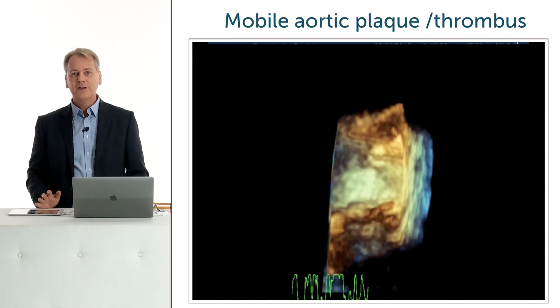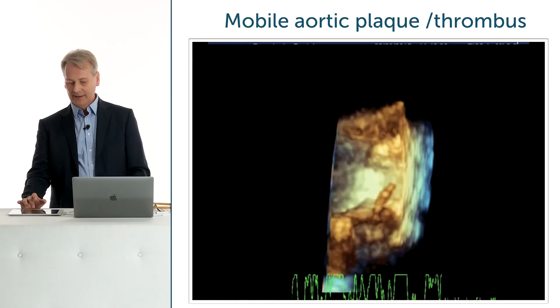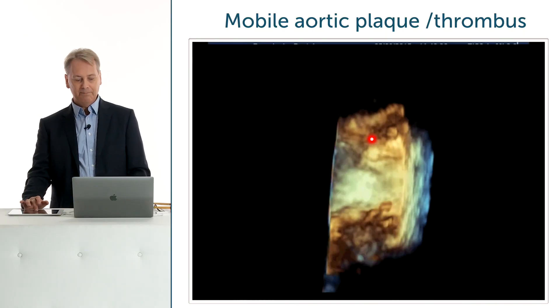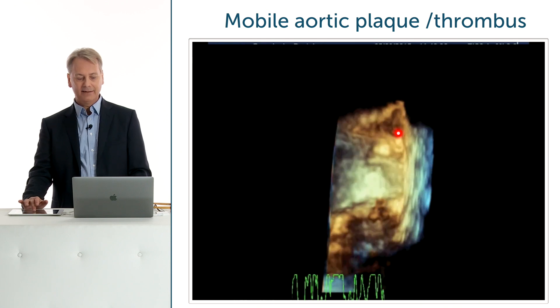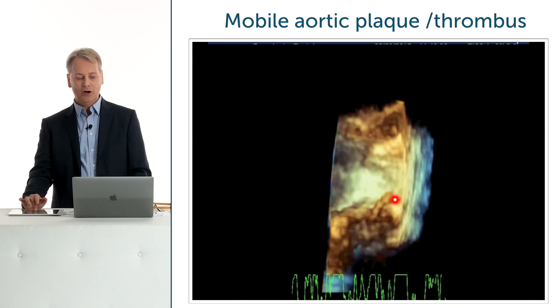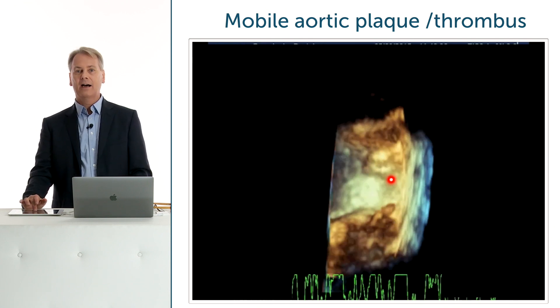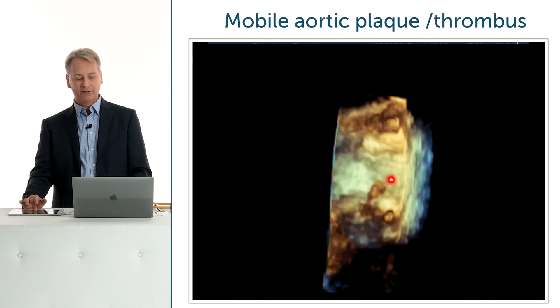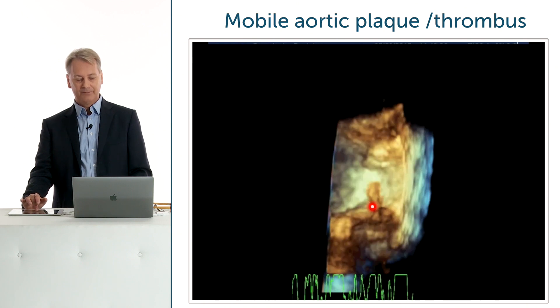We're using 3D not only in the heart, but also for the aorta. A patient who had massive atherosclerotic plaques — this is the aortic wall — and on one of these plaques we have a highly mobile structure, probably a thrombus.